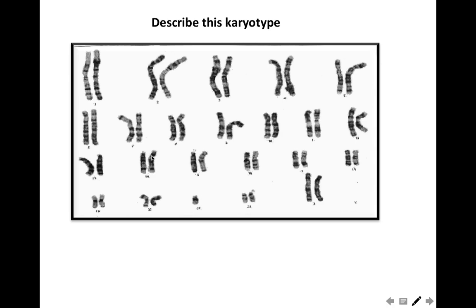هنا السنترومير يبقى في جزء زيادة، الجزء ده بيشبه جدا chromosome 21، بيبقى عنده dark band just next to the centromere وبعدين a light band. يبقى ده is the second copy of chromosome 21 in the form of Robertsonian translocation 14;21. Okay? And the rest of the chromosomes are okay. كل الhomologous chromosomes شبه بعضها and the sex chromosome is XX.